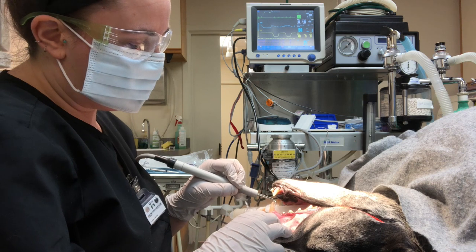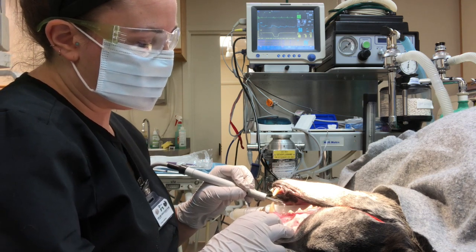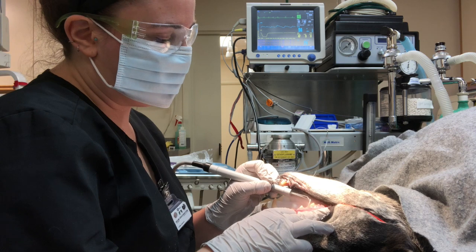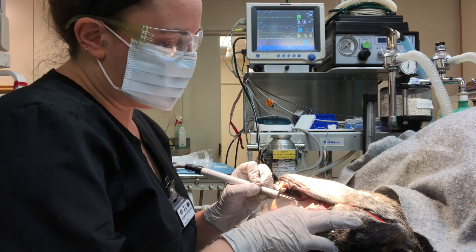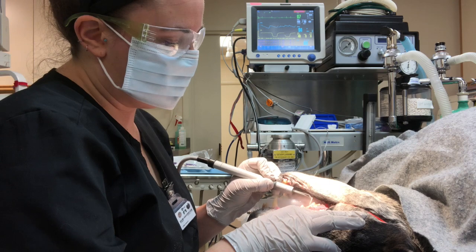So this is coming off really nice with the side of the scaler. And we don't want to be on the tooth for longer than 5-10 seconds. So I usually like to start with the difficult teeth and be on there for about 10 seconds, and then I move away and come back to that difficult, heavy calculus tooth later.